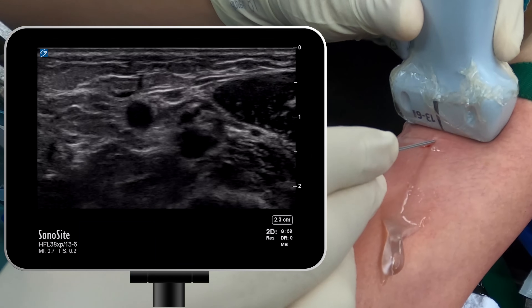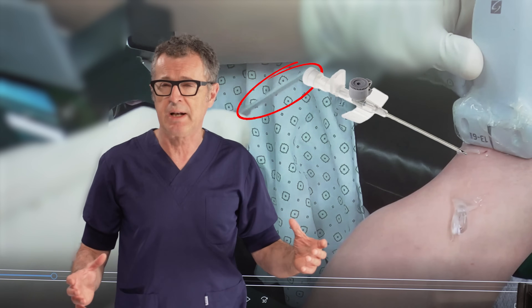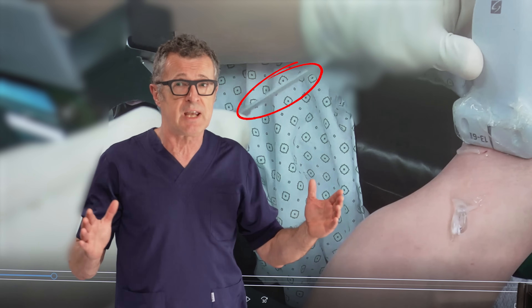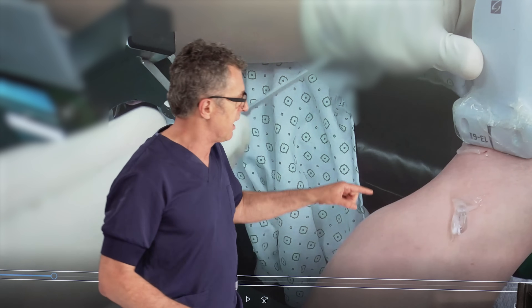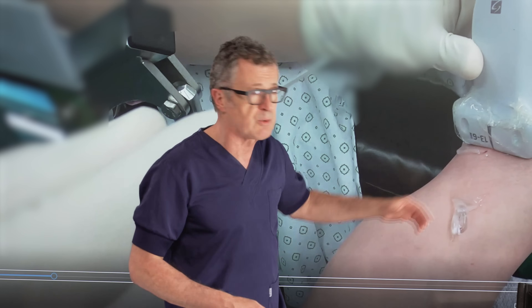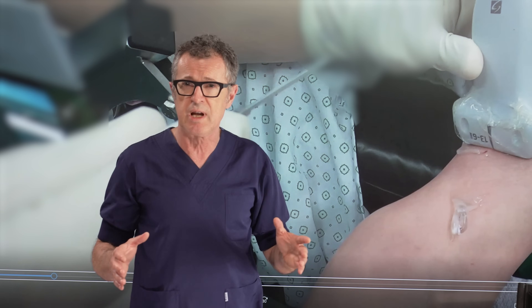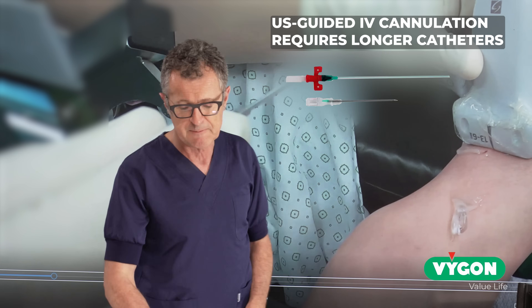Finally, the 16-gauge catheter-over-needle system in our practice is one of the longest, at about 5 cm. You really need a long needle and catheter because you lose a little space inside the skin when using ultrasound. You need a longer needle in order to leave the catheter sufficiently deep inside the vein to prevent dislodgement. When using ultrasound guidance for IV cannulation, you always have to use longer catheters.